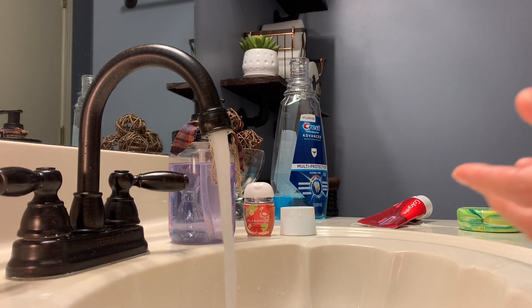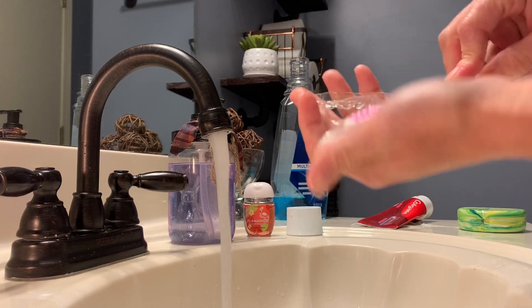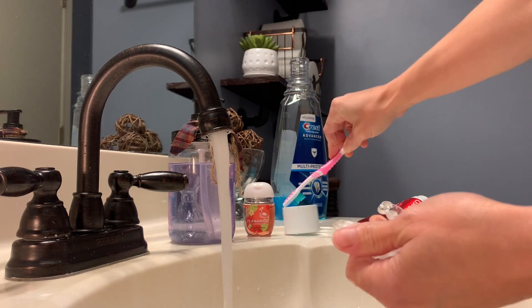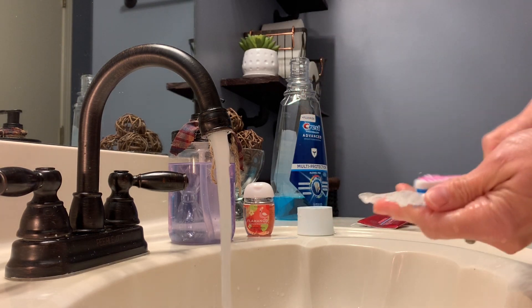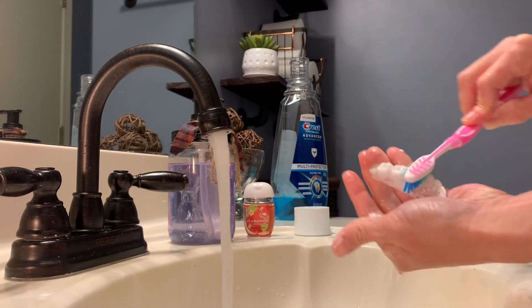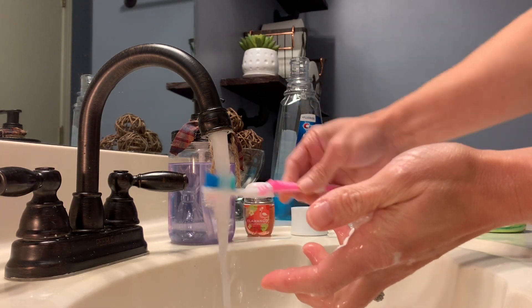Now that you've made up your solution, take your retainer, run some cool water over it to get it nice and wet, then take your toothbrush and dip it in the mouthwash solution. Brush a little vigorously — not too rough — but make sure you get into those grooves to remove any residue from the denture cleanser so you're not putting that back in your mouth. Brush inside and outside, top and bottom, to get every part of your retainer.